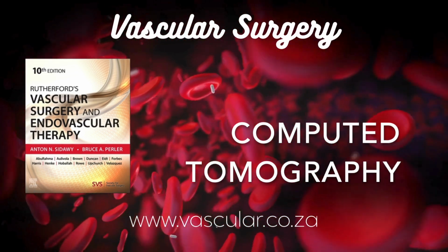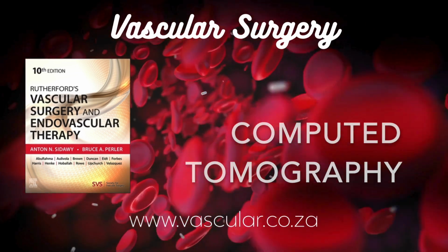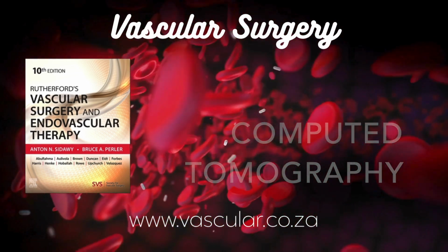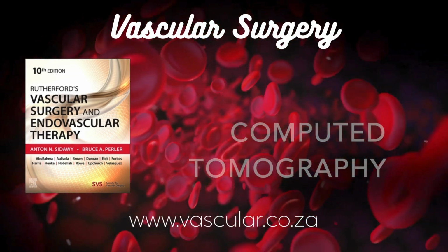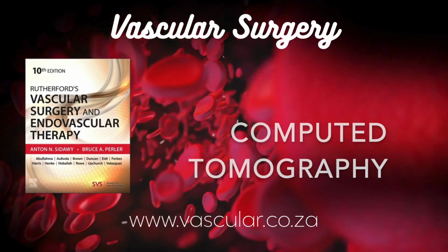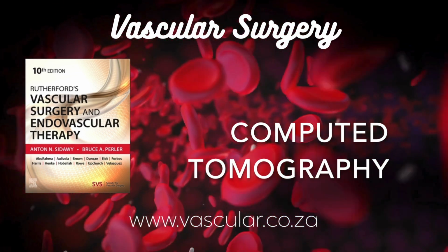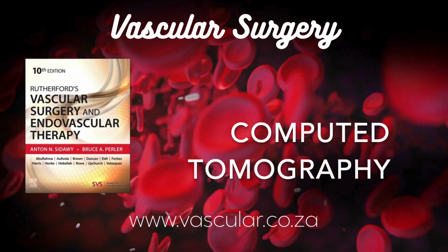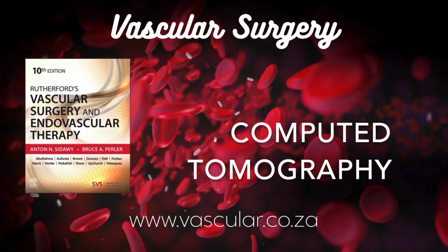And the image detail improved too. Definitely. Along with the faster scanning, computer power kept increasing, allowing for bigger matrices. We went from that early 160 by 160 to the standard 512 by 512 matrix you see today. Much finer detail. And you mentioned pixels before, but the volume scanning, it's really voxels, right? That's the technically correct term, yes. Since we're acquiring data in 3 dimensions, each point in the dataset represents a tiny cube of tissue, a volume element, or voxel. The 2D images we look at are just representations of that 3D data.